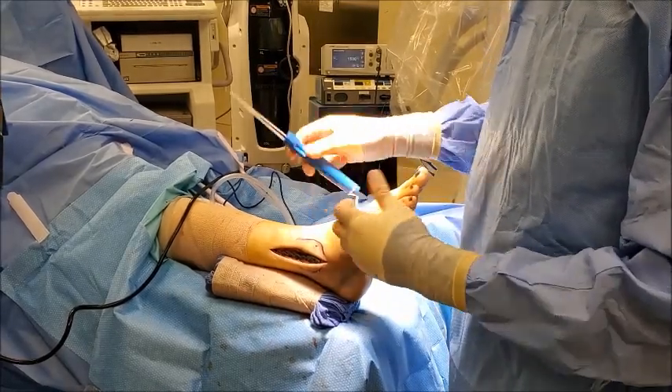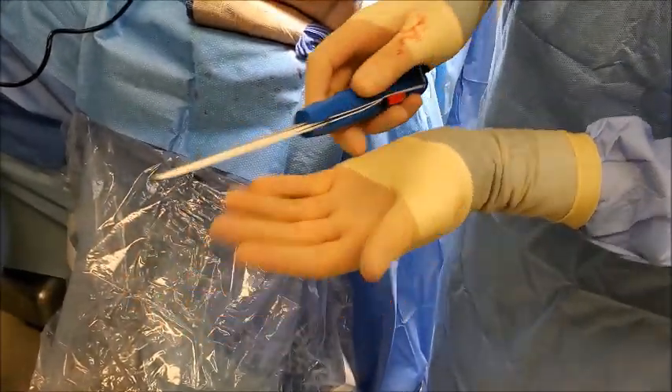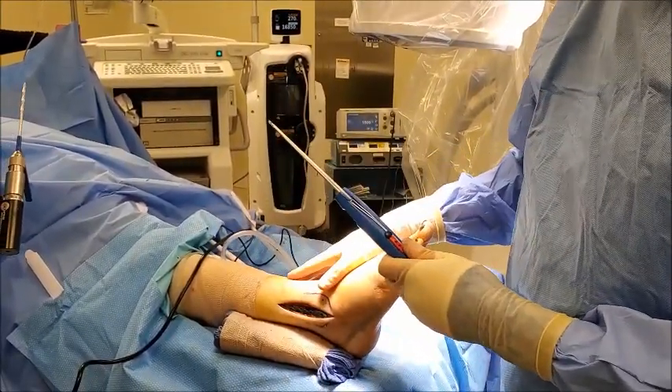The last portion of the procedure is putting in this small anchor — it's a little metal button there, and another little metal button here. By cinching those together with the suture in the middle, it'll bring those long bones back together and re-stabilize that ankle.